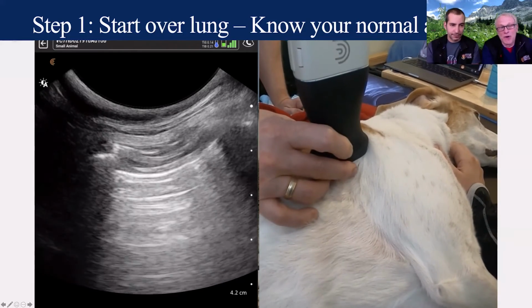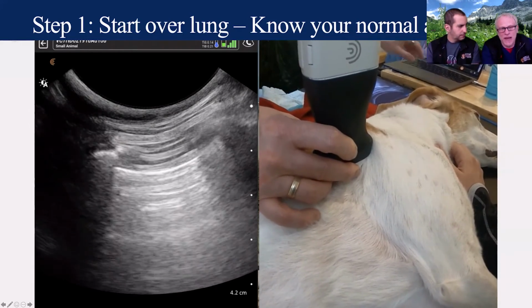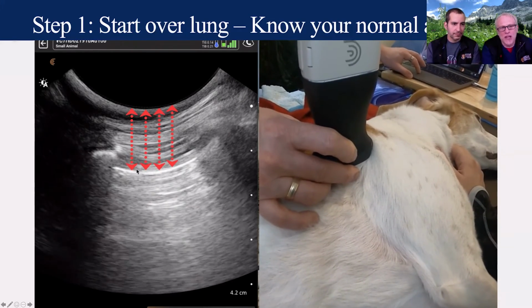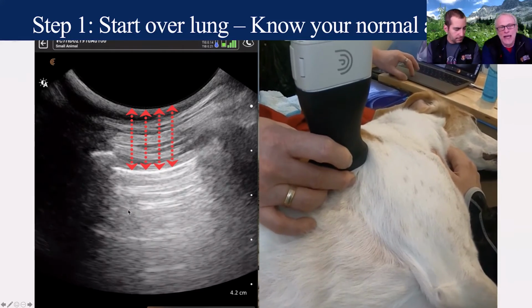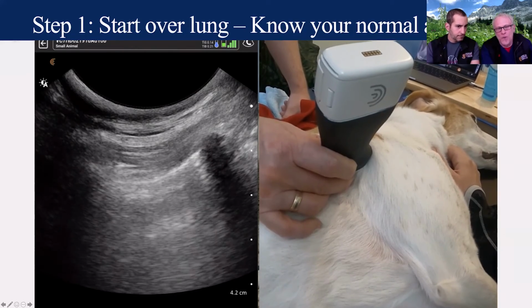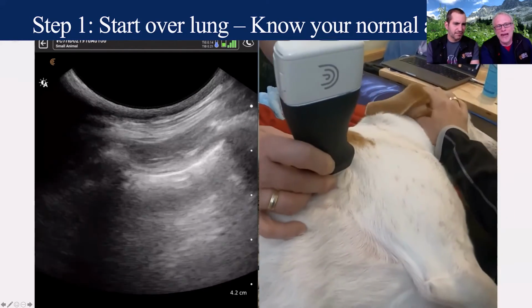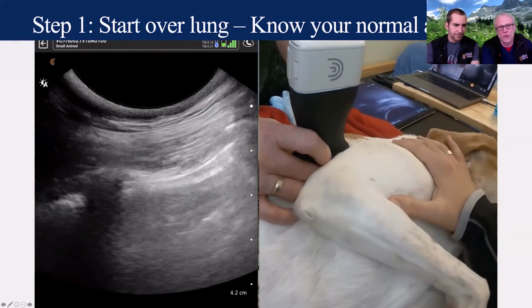Absolutely. And if I'm really perpendicular, you can see how bright white this is now. And I can see these reflections of that pleural line to the far field. That's because I'm very perpendicular and the ultrasound beam bounces back and forth between the probe head and that pleural line. If I angle, what we call changing the inclination, the angle at which I hit that pleural line, look how oblique that is. We actually make this grainier, and the more grainy the pleural line, the easier it is to see. The other thing we can do, Dr. Chalhoub, what else can we do?